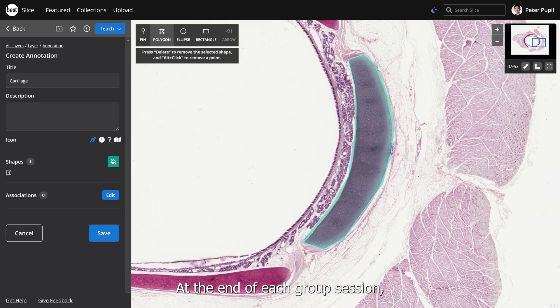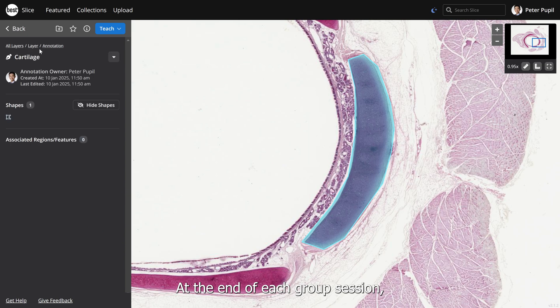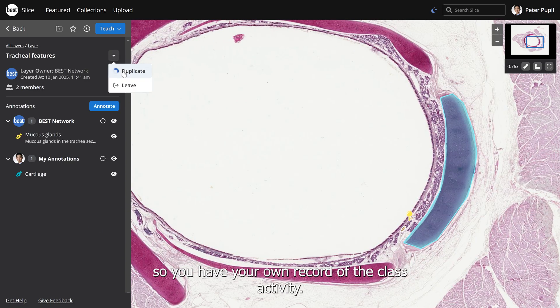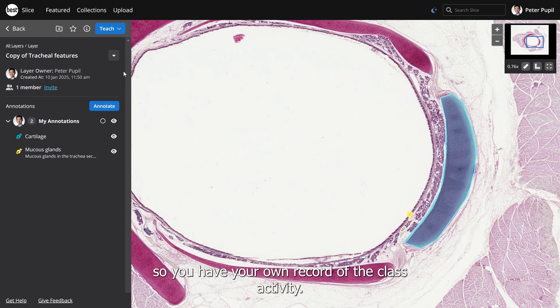At the end of each group session, we recommend duplicating the layer into your own account so you have your own record of the class activity.